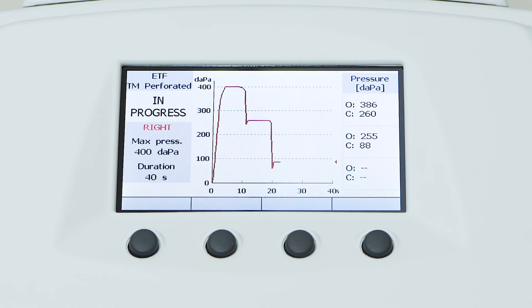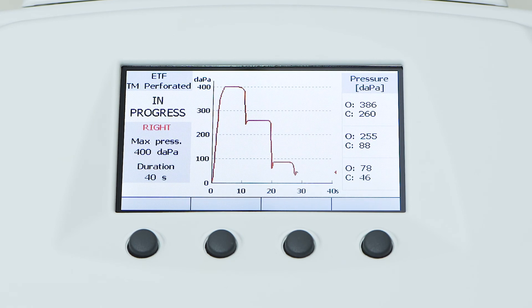Accordingly, these pairs of values can identify the pressures at which the Eustachian tube opens, indicated by the label O, and closes, indicated by the label C.